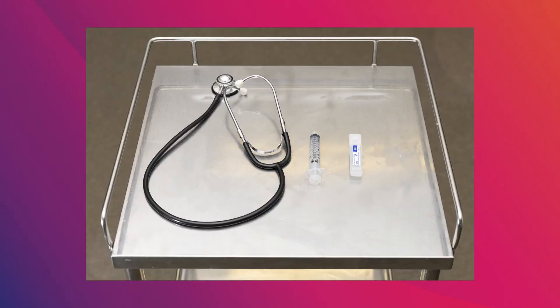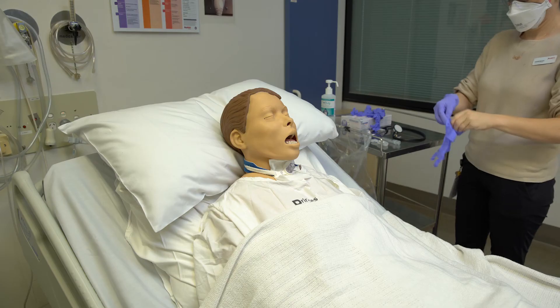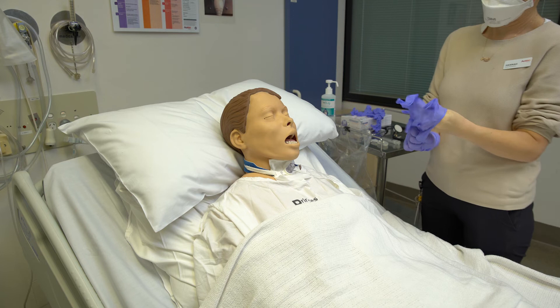Prepare the necessary equipment. This will include routine tracheostomy PPE as per hospital policy, a 10ml syringe, a water for injection ampoule, and a stethoscope. Perform hand hygiene and put on PPE.